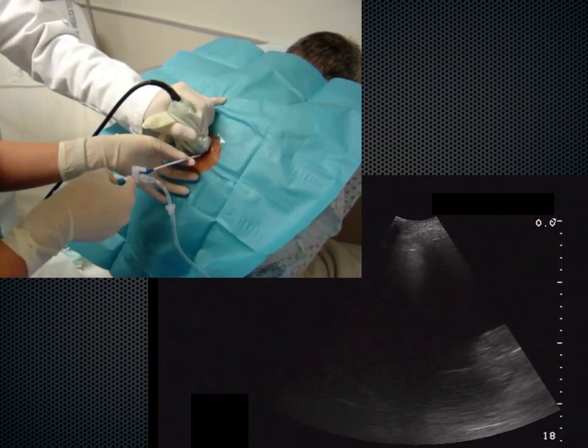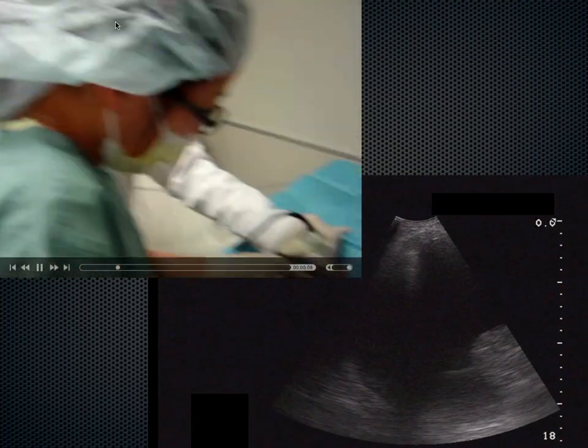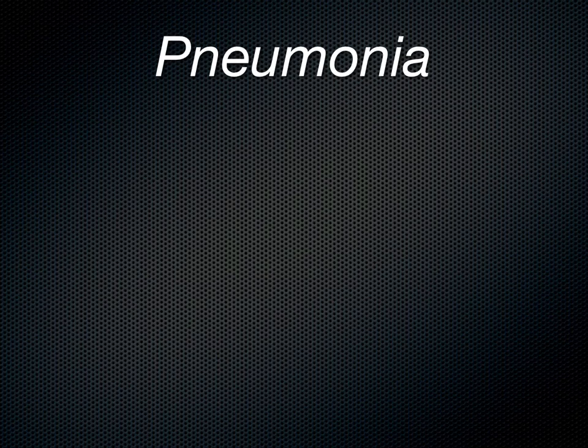So sometimes it takes two operators depending on your kit. Just incorporate someone else in your field. This person should have a mask on. The pic here is an example of how you can basically watch in real time what's going on.